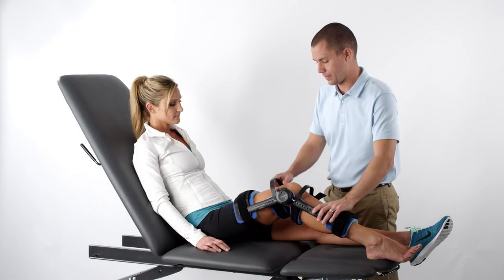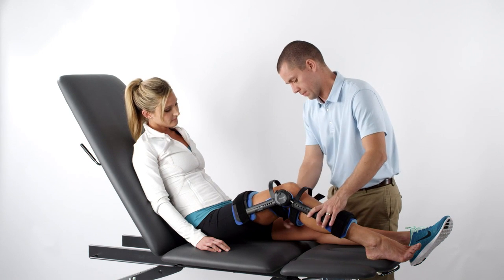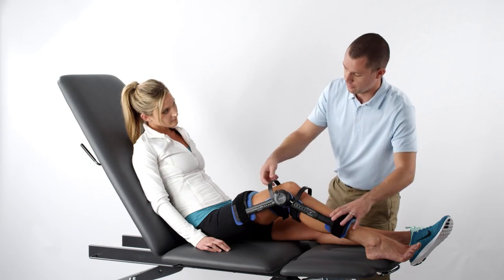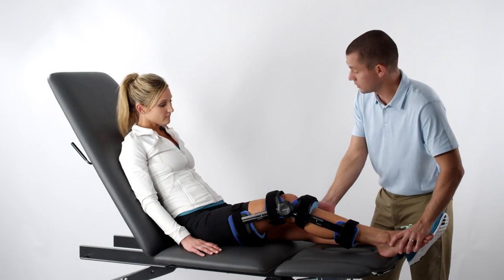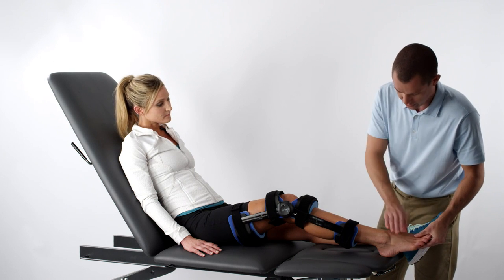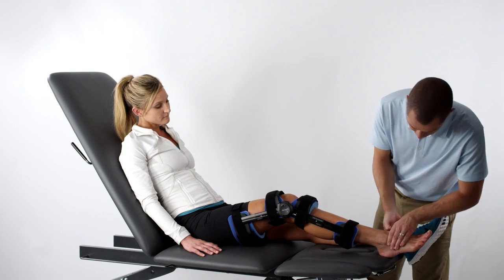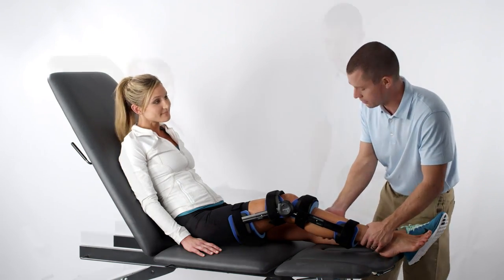On the knee flexion orthosis, you may attach the middle straps loosely, since their purpose is to keep the stabilizing bars in place. When the device is secure and the patient is comfortable, check for any neurological or vascular changes. The patient should not experience any numbness or tingling while they wear the orthosis.